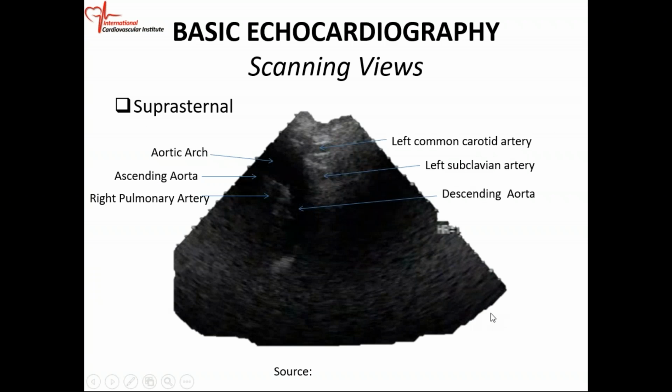You want to get something looking like this. So it might not project clearly, but you can see this sort of arch. Okay, so you can see this darkened area that comes over like that. So this is our ascending aorta. The aorta ascends. This is the ascending aorta, the aortic arch, and this is descending aorta. So this is what you're going to get.